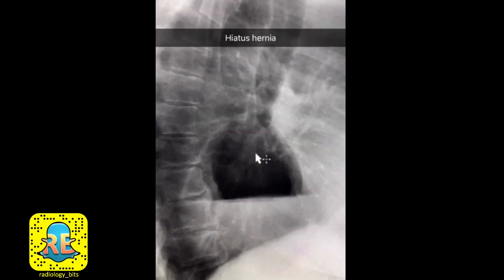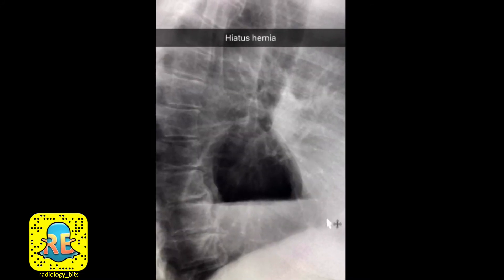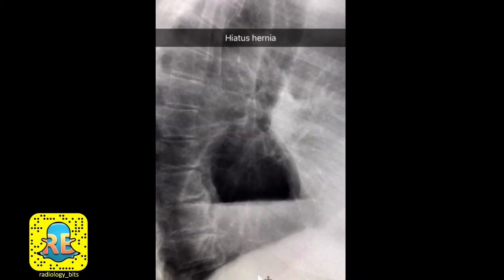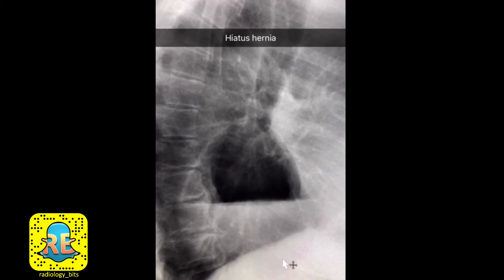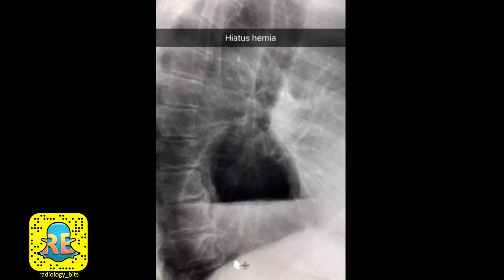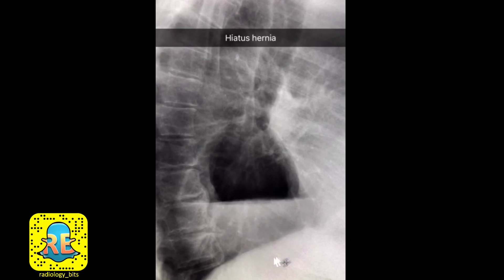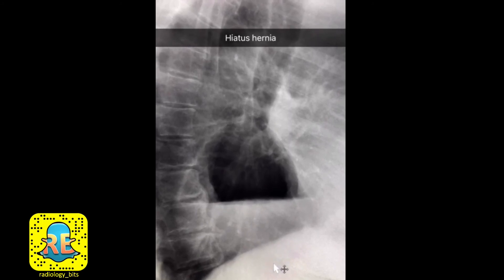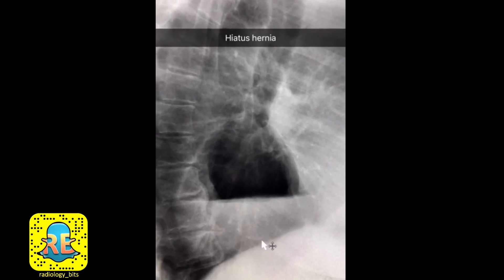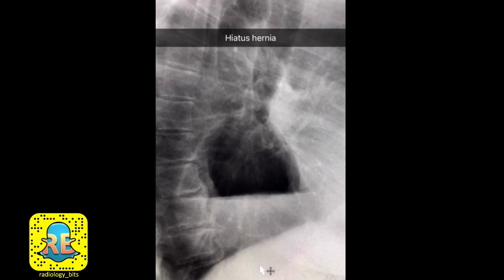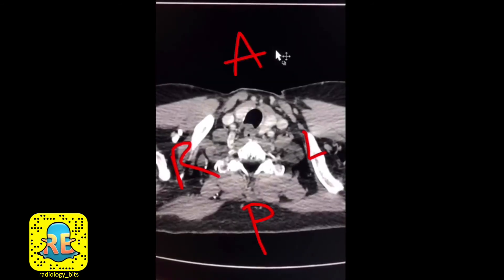The abnormality has the same appearance: air above and fluid below with a straight fluid level in between. A very common reason to see such an appearance is a hiatus hernia. The contents of a hiatus hernia ascend from the abdomen through the diaphragm into the chest, typically through the esophageal hiatus. The amount of structures contained there depends on the size of the hernia — you could have part of the stomach, the entire stomach, or even other organs.